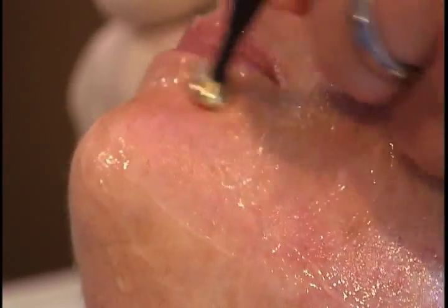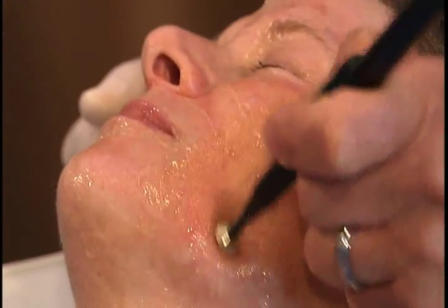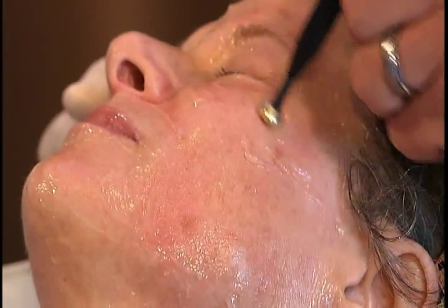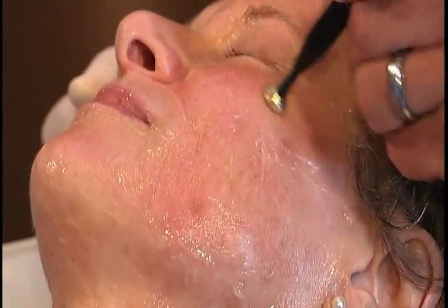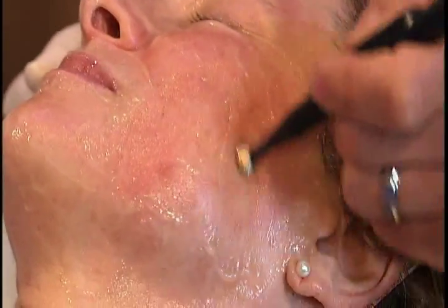Don't forget the chin. The chin ages and becomes soft and amorphous, so you get some nice firming and shaping of the chin. In her case, you'll probably see it kind of pointing in one direction after we've treated just one half. So just a couple passes over that malar pad to firm the surface.